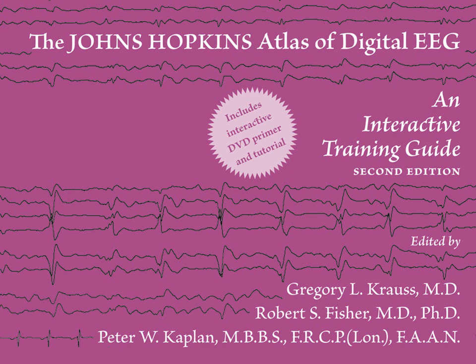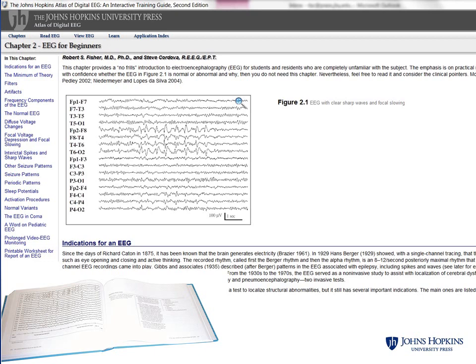The Johns Hopkins Atlas of Digital EEG is a robust, multifaceted, multimedia toolkit that provides neurology residents, EEG technologists, and physicians with detailed instruction in reading and interpreting digital EEG. Now in its second edition, the atlas incorporates nine chapters of text-based instructional material to teach the fundamentals of EEG reading. This material is included in both the printed book and the digital atlas.